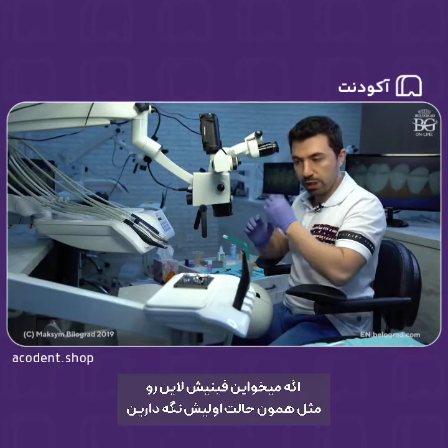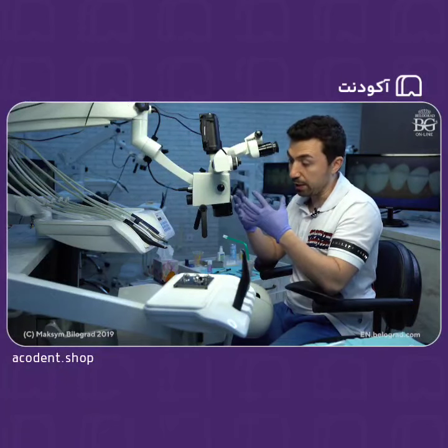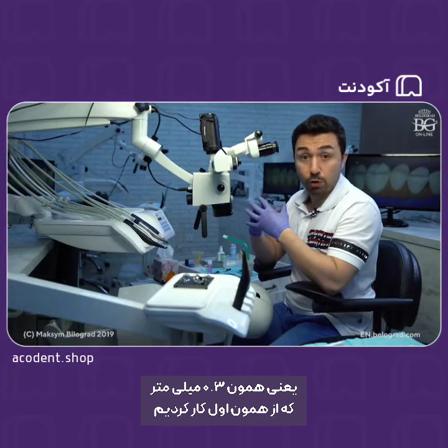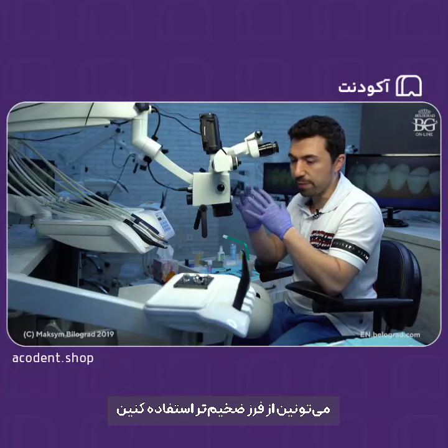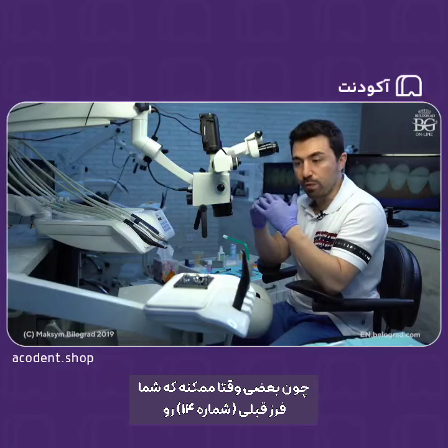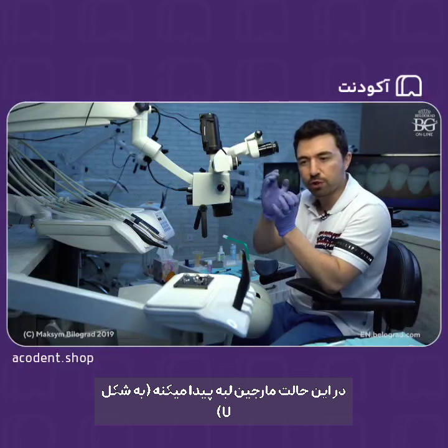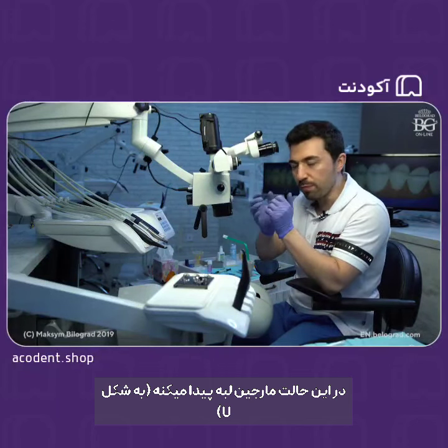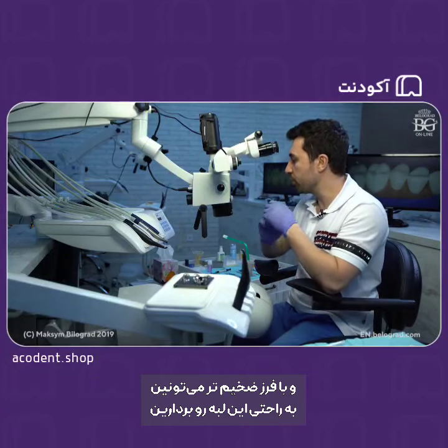If you would like to keep your finish line same as it was done previously, basically we make it 0.3, and you would like to keep it 0.3, you can use thicker burr, because sometimes you can get your burr number 14, the previous burr, a little bit deeper than half of the tip, and in this case you may have a small U margin, small lip margin. Okay, and with a thicker burr you can take this lip in a really easy way.